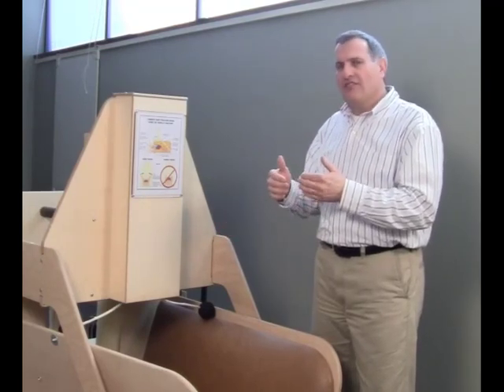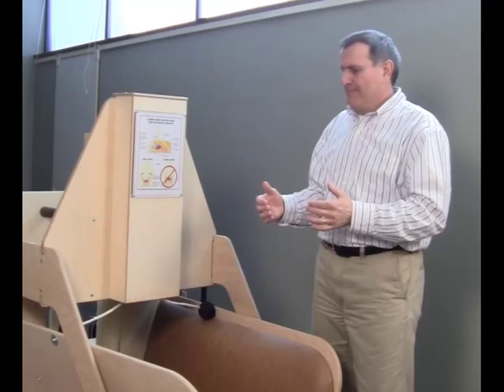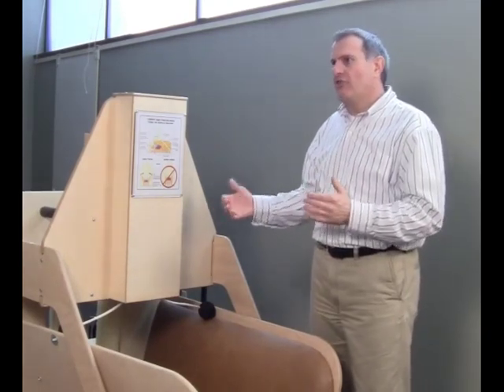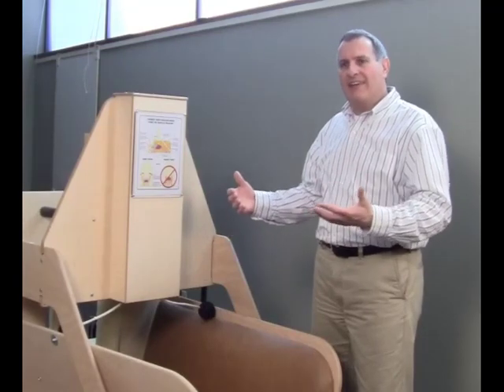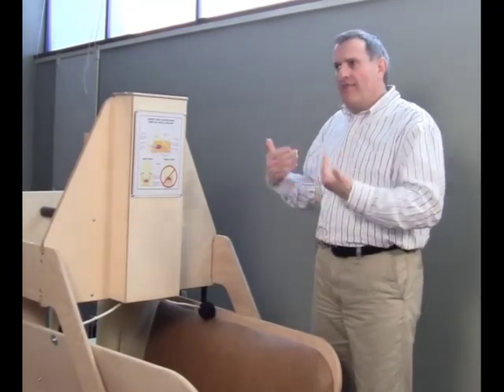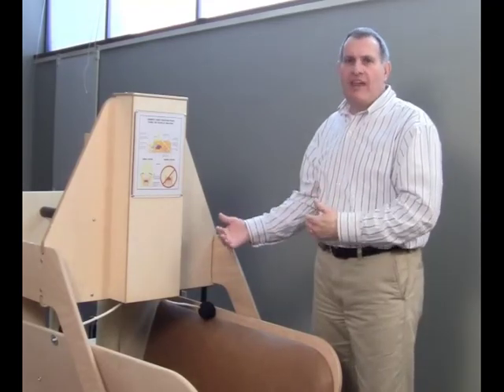And so they can actually develop almost an immunity to the tactile defensiveness over time, to where they can actually tolerate people hugging them after they get used to that feeling and know that it's safe and it's secure.